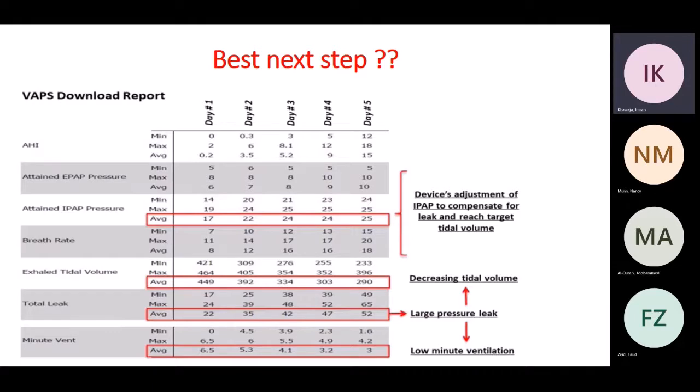Yes. So know what kind of device you're dealing with, ResMed or Philips Respironics, and what kind of mask this patient is wearing. Is it a full face mask or a nasal mask? Because that can determine when to say that the leak is on the high side or within normal limits. Did that answer your question? It's not simply, okay, full face or nasal. It's more complicated, guys. I'm just telling you the easiest way to approach this, because there are tables you can go by.